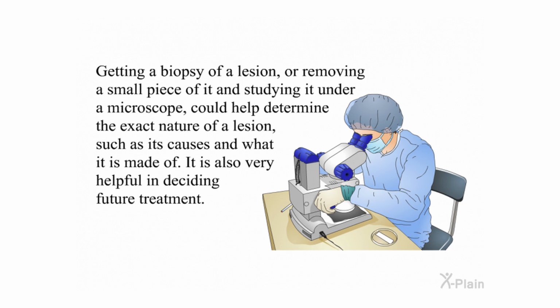Getting a biopsy of a lesion, or removing a small piece of it and studying it under a microscope, could help determine the exact nature of a lesion, such as its causes and what it is made of. It is also very helpful in deciding future treatment.